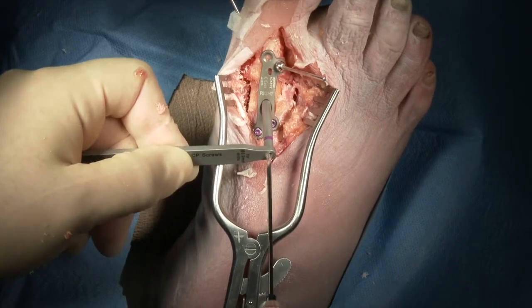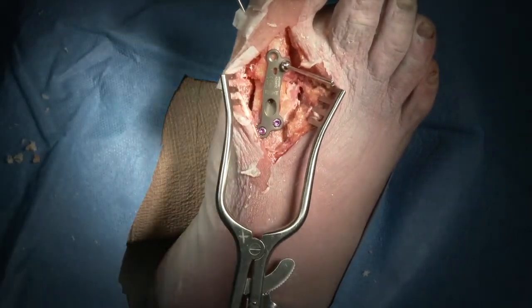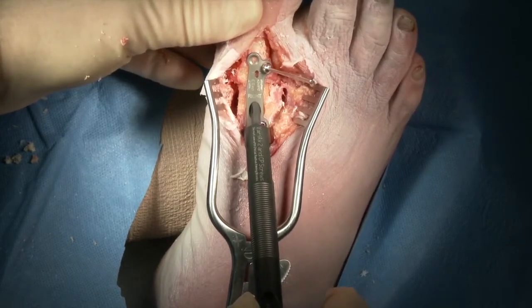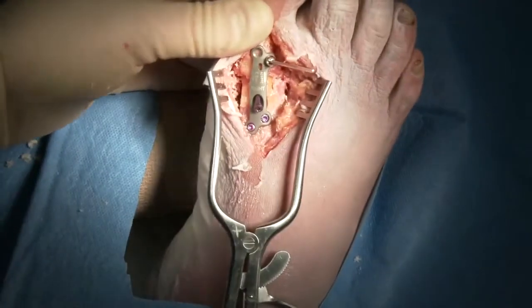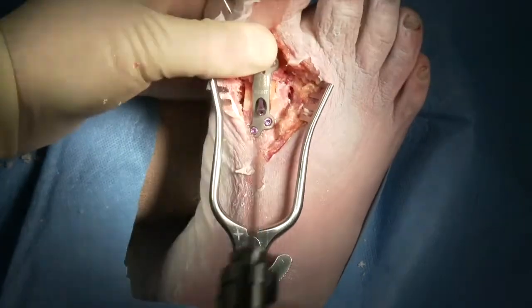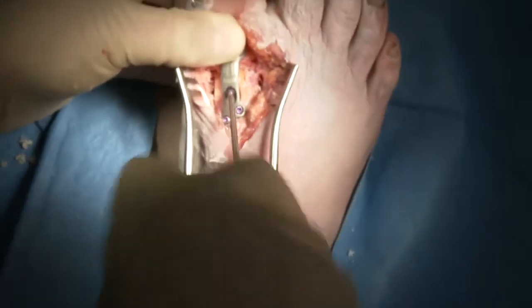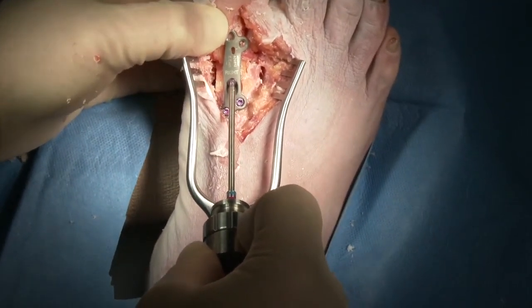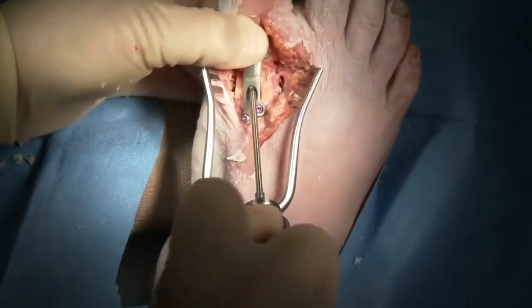The CP drill guide is then utilized, and again this has a variable axis to it. We're aiming for the plantar distal aspect of the proximal phalanx, and you want this drill hole to go through the cortical bone on that plantar aspect. When you place your depth gauge in here, you should be able to feel it penetrate the plantar distal cortex of the proximal phalanx — you want this screw to be a bicortical screw. The CP screw itself is partially threaded to gain compression. The screw is introduced into the plate until it makes contact, at which point you remove the olive wire. As you begin to gain your compression, you must also remove the temporary fixation pin that was placed, otherwise it will block penetration of the joint. Then you can get your compression by introducing the CP screw until it tightens.